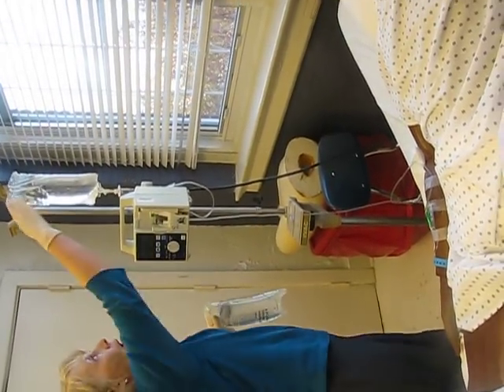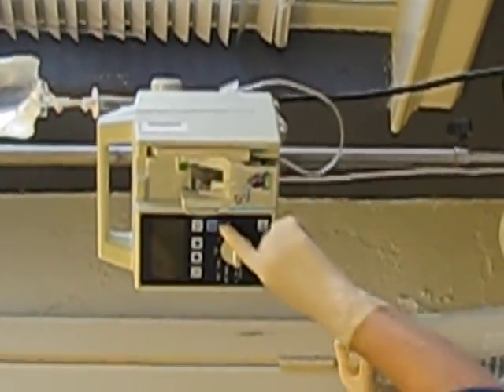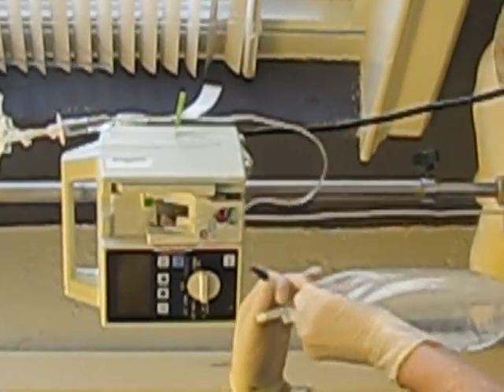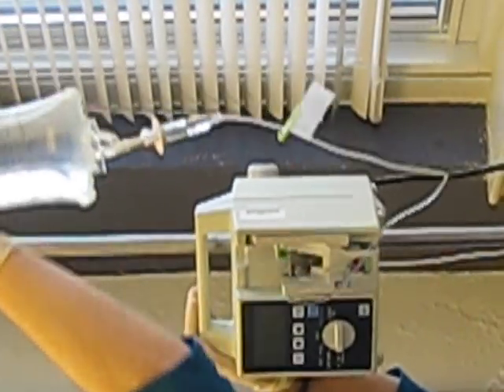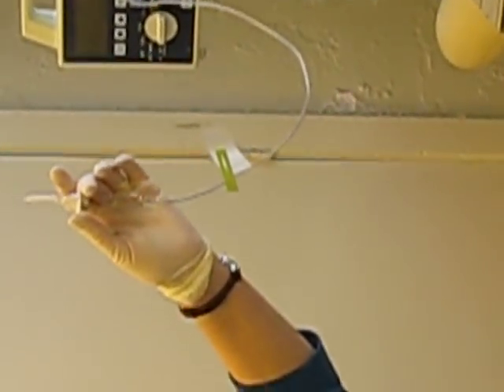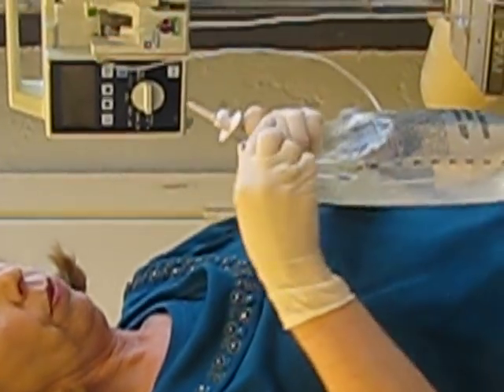So we would say that all of this bag is out. Okay, so we're going to turn off our machine or hit hold — whichever one you want to do. You're going to close your slide clamp. This is empty. And you're going to take this off. This would be empty, so it's very likely to splatter on you. And which one of these do we open? The blue. Just open up the blue. Everything's turned off.